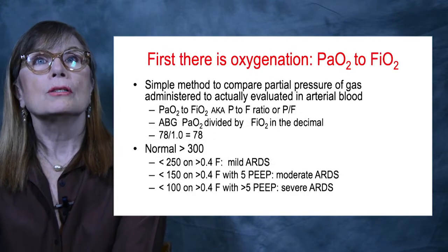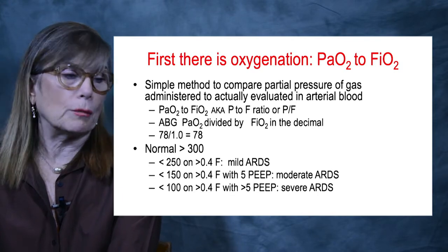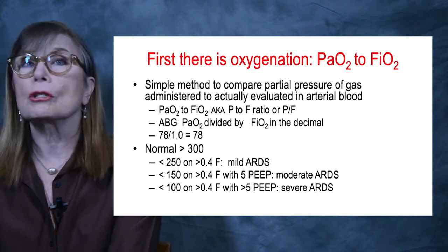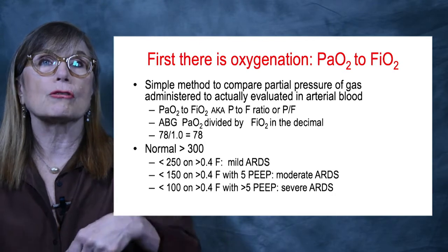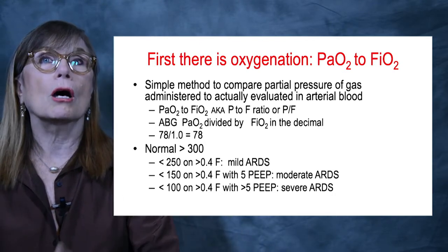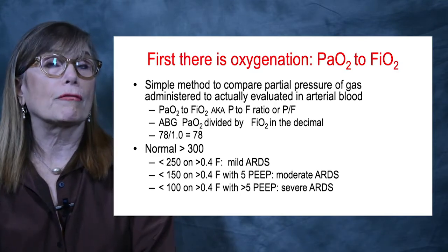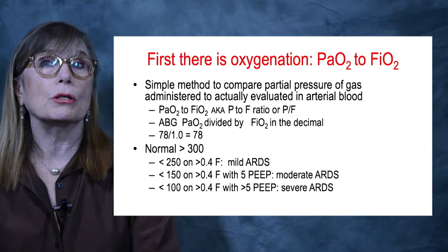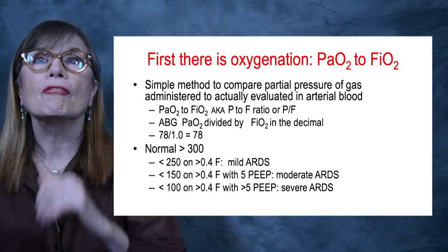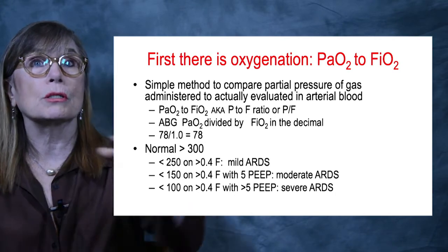Okay, so one of the things that I'm always really in support of is that bedside nurses should be communicating to their providers not just PO2 and not just SaO2, but also the P2F ratio. So the way people refer to that is PaO2 to FiO2 or P2F or the PF ratio. There's lots of different terms.